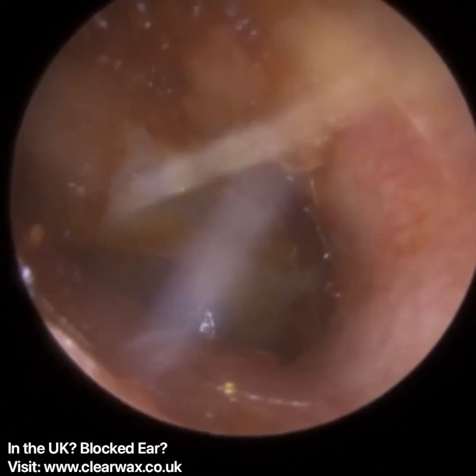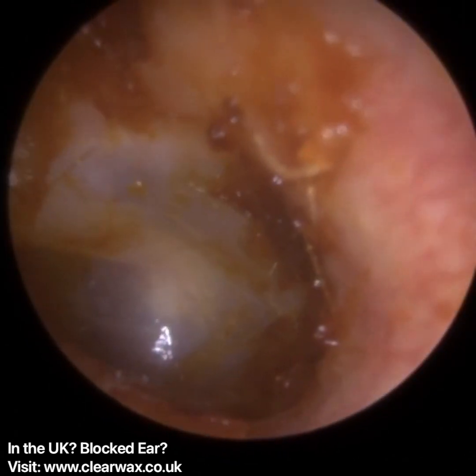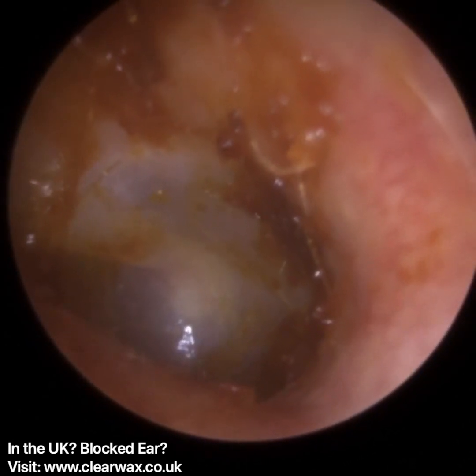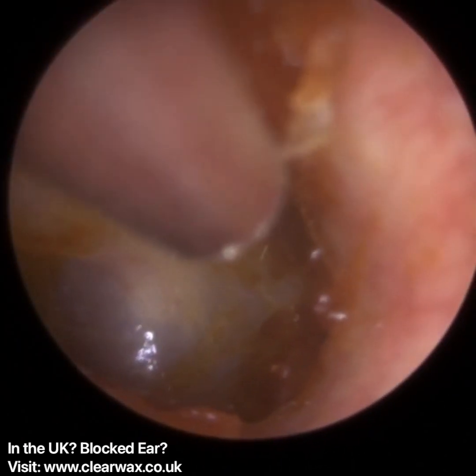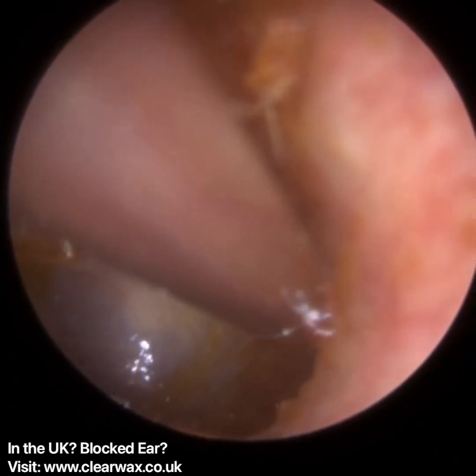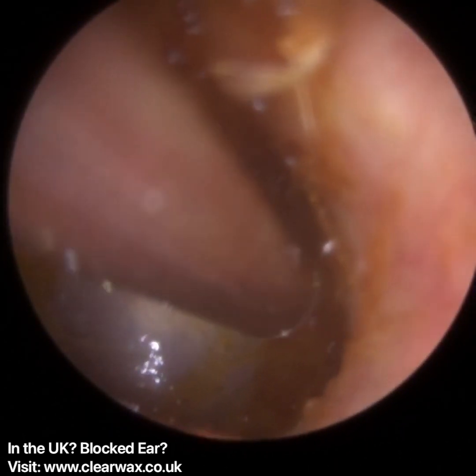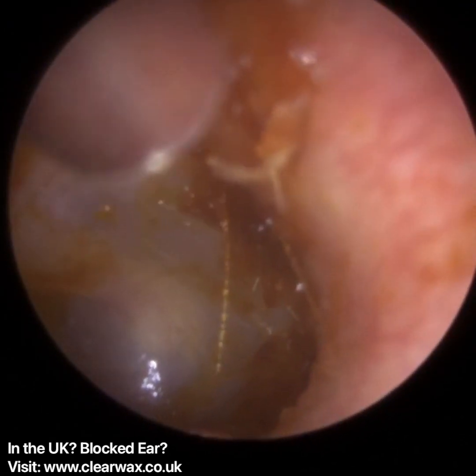So what I'm just trying to do here, if this sticky wax that's coating the canal wall comes off very easily, then I'll just hover over it, but I'm not going to try and remove all this because it's going to be so uncomfortable for the patient, and the blockage is gone now. We can see the eardrum fully. Again, I'm just hovering over now. If it's coming, it's coming. If not, I'm just going to leave it in there, and I'm not going to make any excuses or apologies for it.